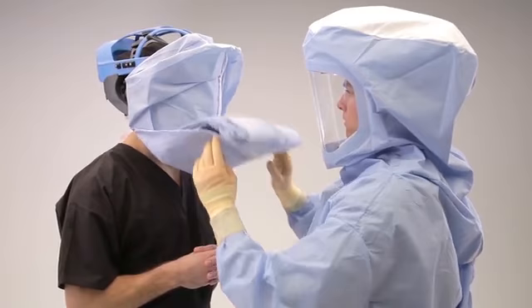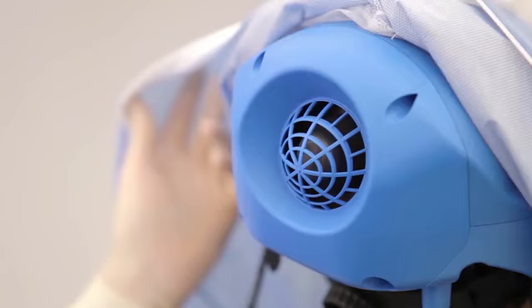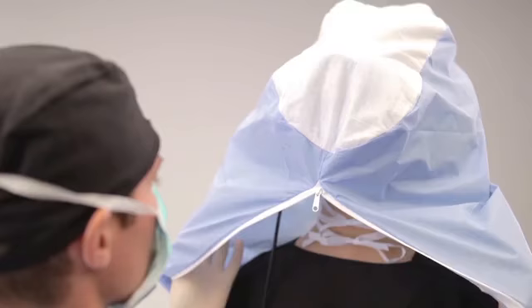Carefully pull the toga up and over the helmet. Let the toga unfold over the shoulders and down to its full length. Grasping the inside of the toga, pull the toga completely over the rear of the helmet grill and ensure the filter is properly placed over the fan inlet.